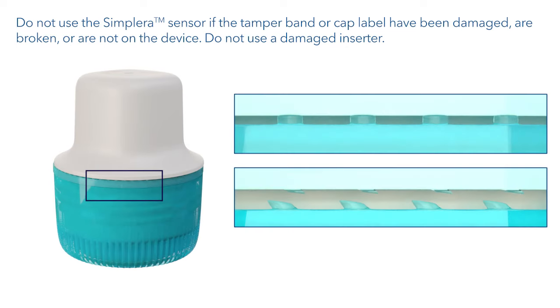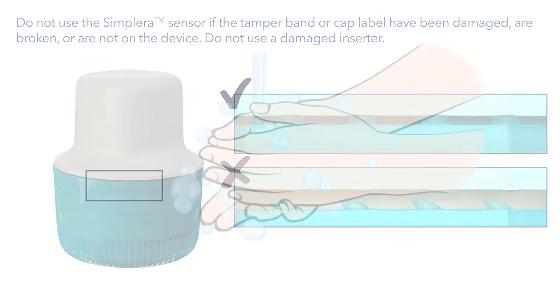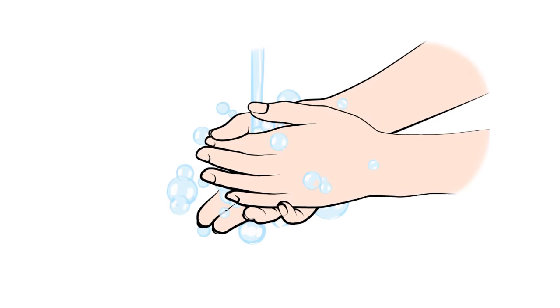Check the tamper band to make sure that it does not have damage, is not broken, or is not missing from the sensor. Make sure to wash your hands before you begin.